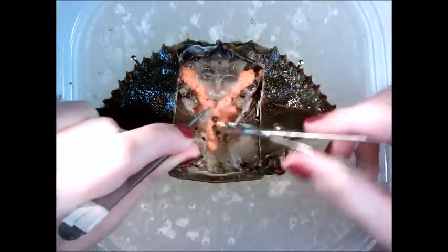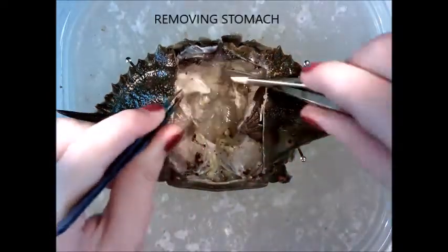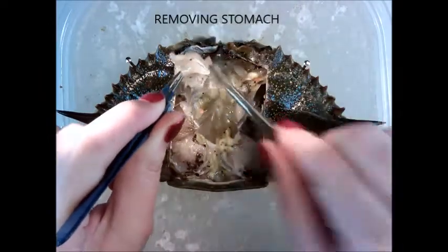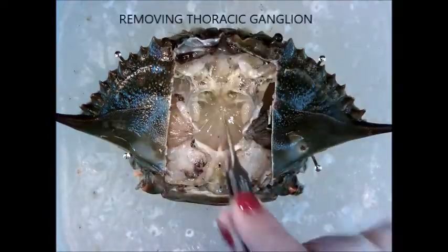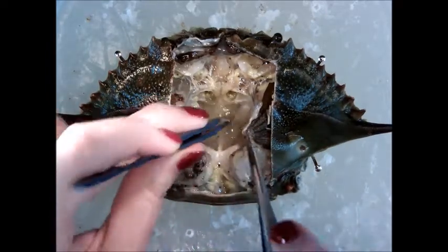Next, we remove the stomach and intestinal tracts to extract the thoracic ganglion. The brain is the next organ to be dissected, followed by the two pericardial organs. After the preps have been removed from the crab, they are fixed in paraformaldehyde for 4 hours.